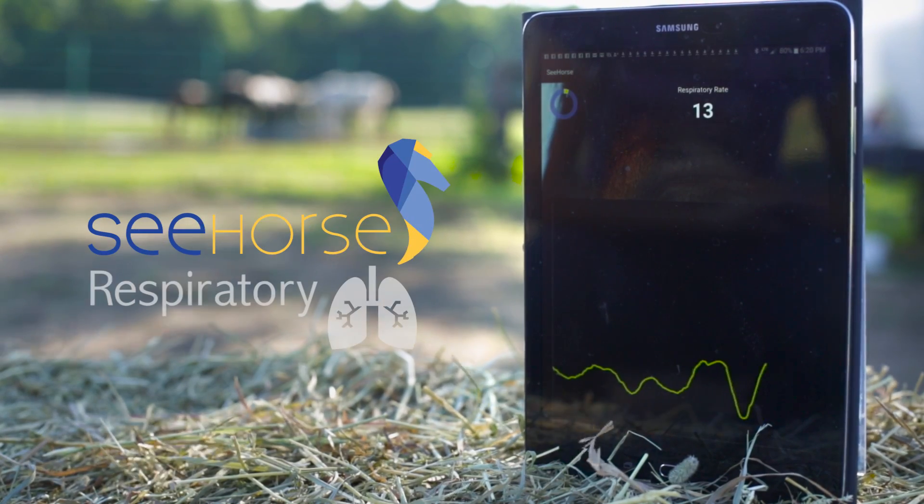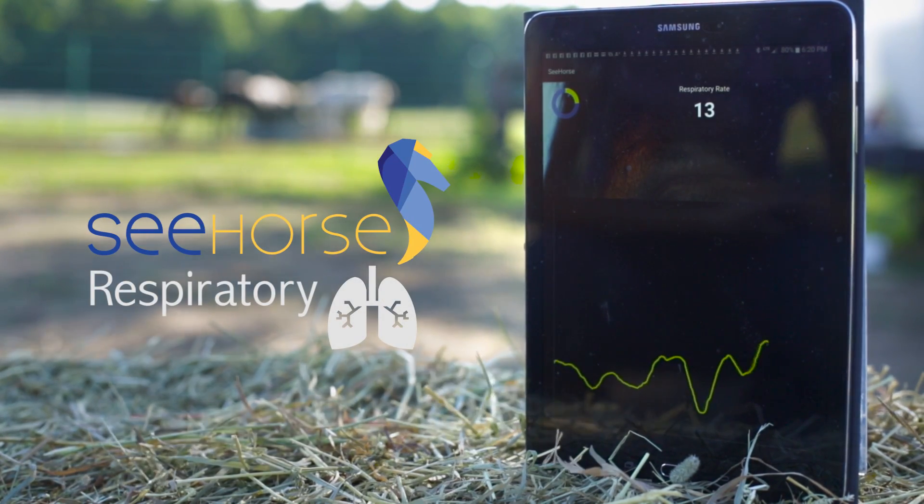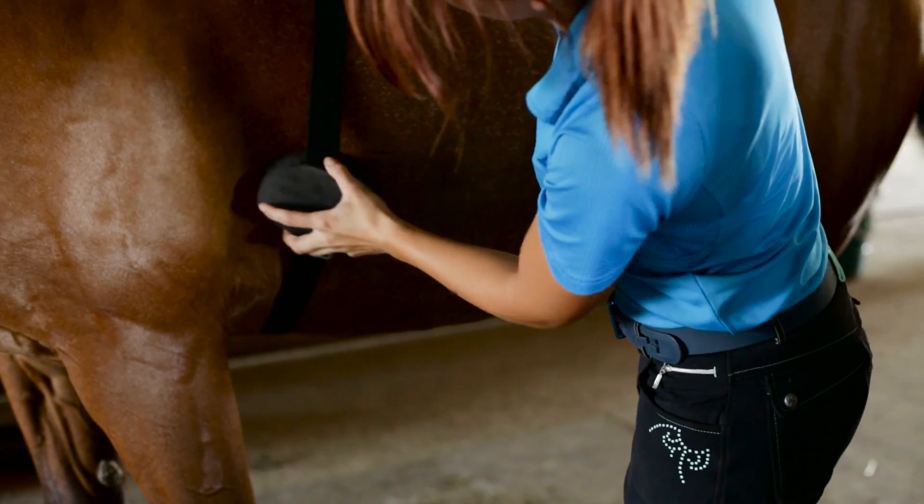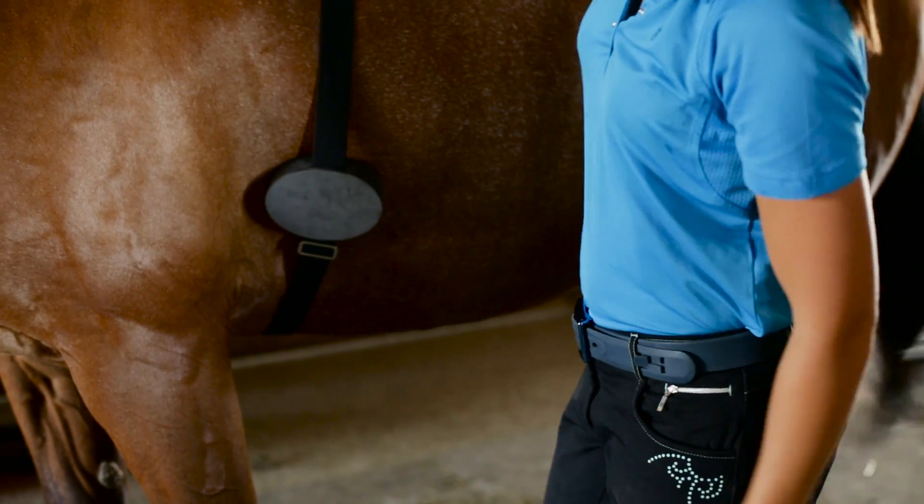Taking your horse's respiratory rate using SeeHorse is very simple. Simply attach the SeeHorse device to the included belt and place the belt around the largest part of your horse's rib cage.